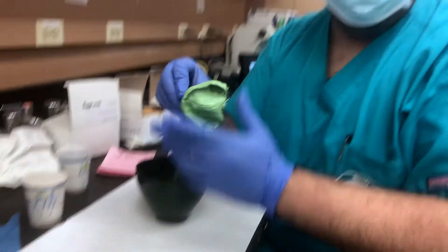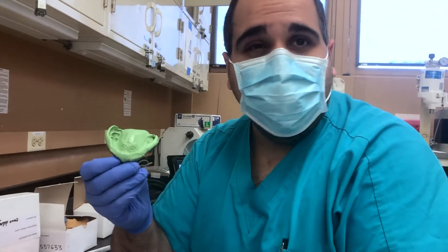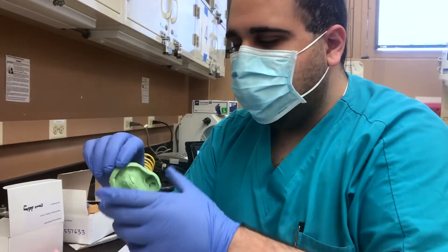Okay, hey everyone. We're going to do a little demonstration of how to box and pour your final impression for complete dentures, partial dentures, or immediate dentures — whatever you're doing. It's really important to know how to box and pour.